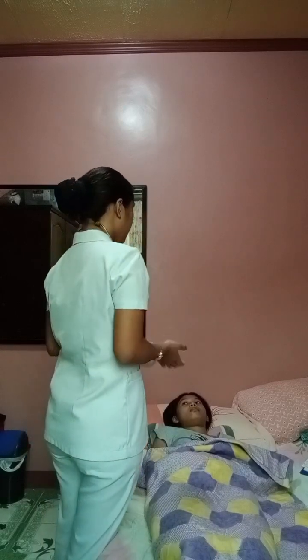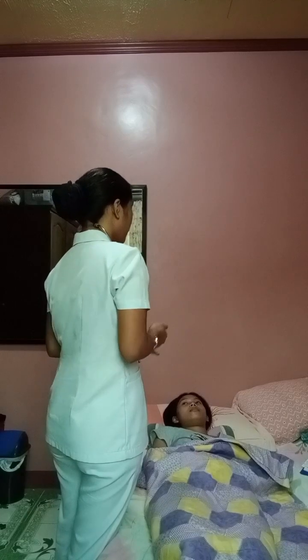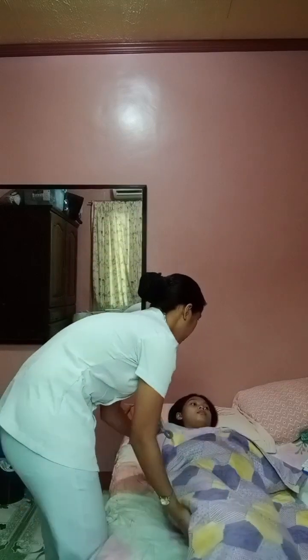Okay, so I'll be repeating the steps earlier, but this time I'll be needing you to lie laterally on your left side. Okay, so I'll assess you now in a sideline position. Okay, so I'll be using the diaphragm of my stethoscope for the high pitched sound.